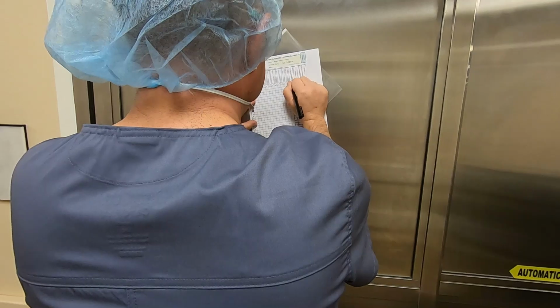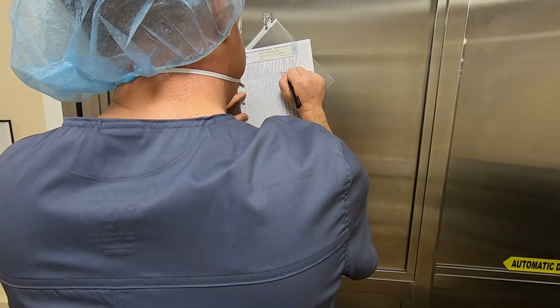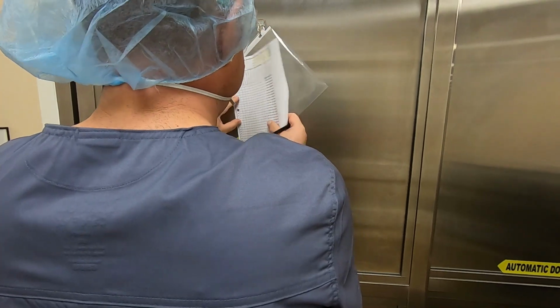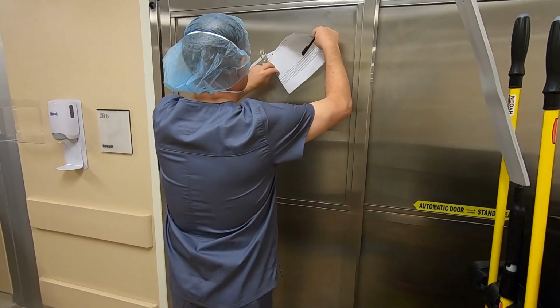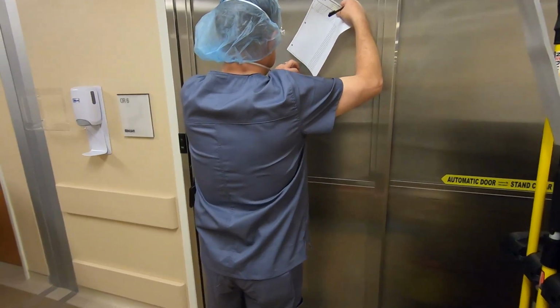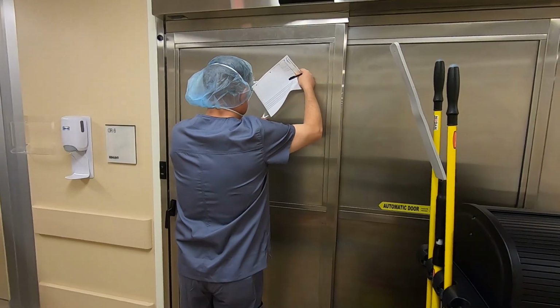12.3 AORN Guidelines measure cleaning practices using qualitative methods for visual observation of the cleaning process, visual inspection of cleanliness and fluorescent marking, and quantitative methods such as cultures, ATP monitoring. AORN Guideline 12.3.2 provide feedback of assessment findings to personnel and leaders.